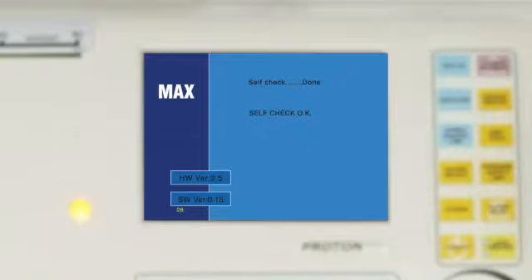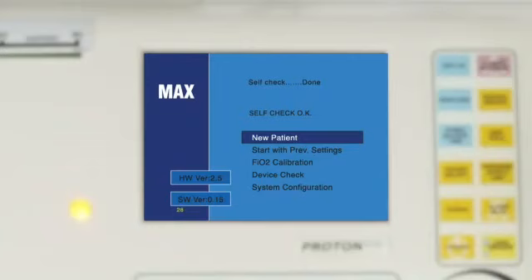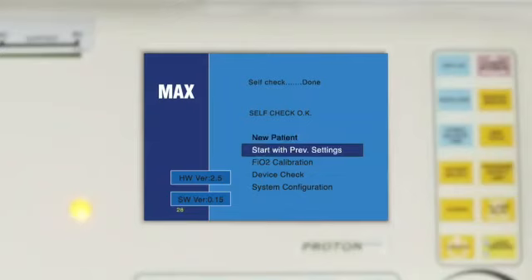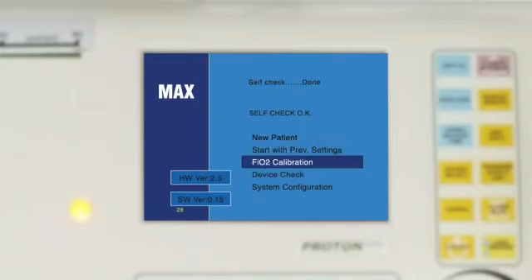Main menu: The main menu has five options - new patient for connecting new patient to the ventilator, start with previous setting, select a previous setting, and FiO2 calibration which allows direct FiO2 sensor calibration.